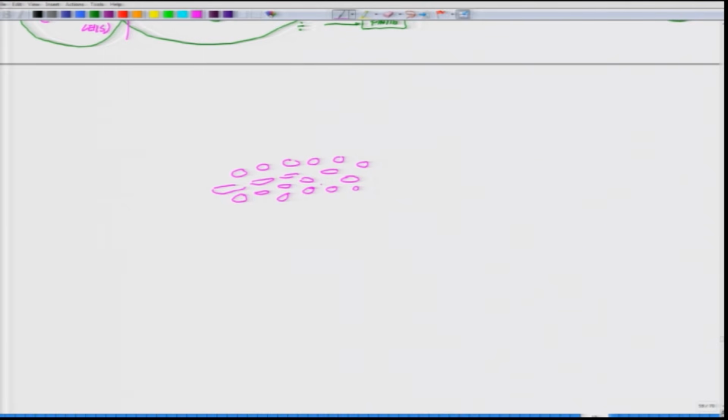So, in the first case study, you put the peripheral neurons first, followed by Schwann cells second. You can reverse the order.